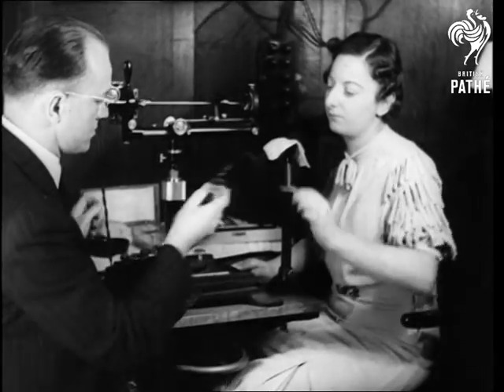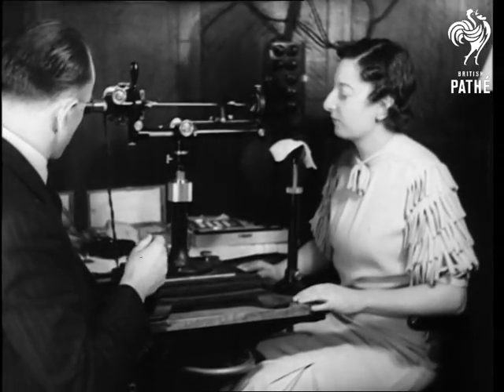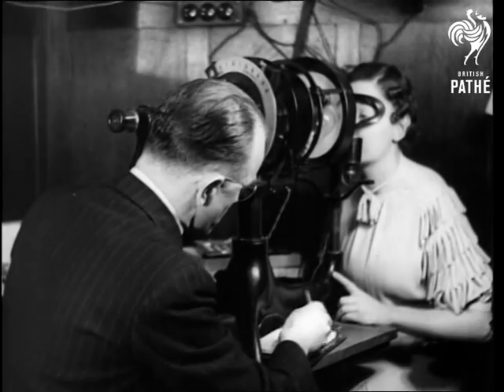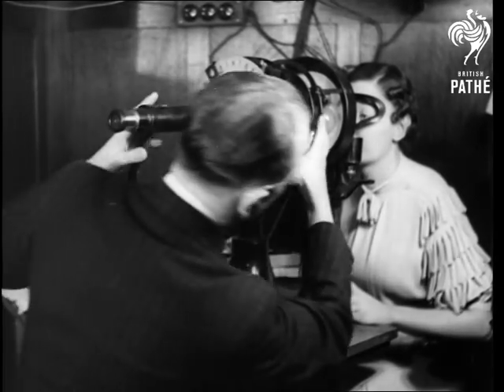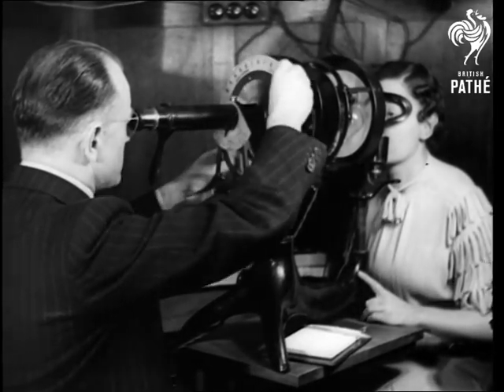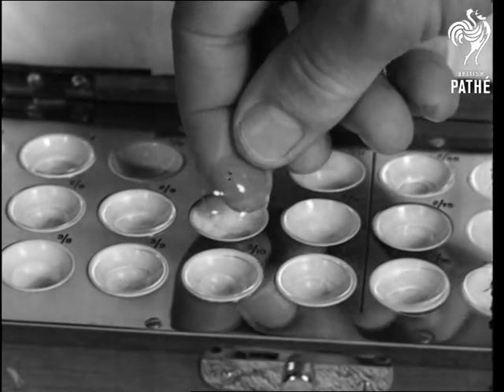Let's take a pair of sparkling eyes and, by kind permission of their owner, examine them. Chin comfortable? Right. Then we'll just take a look at those orbs through this delicate instrument to measure the refraction. The marked wheel indicates exactly the kind of lens required, but the lens itself is an eye-opener.